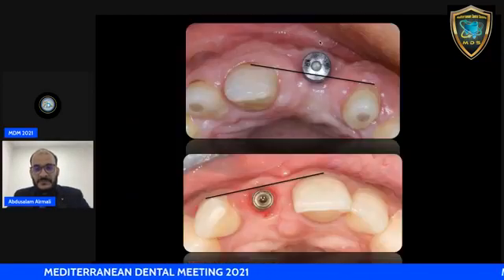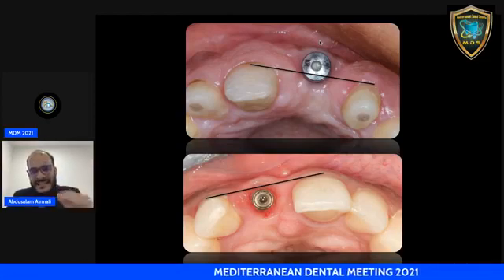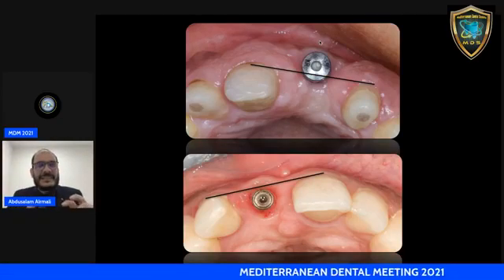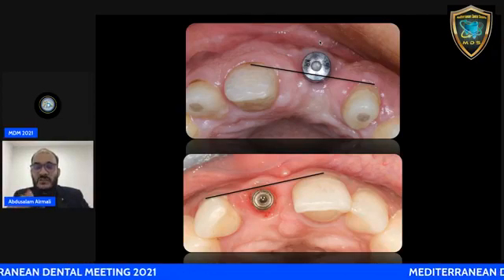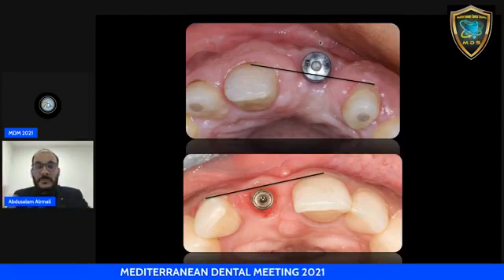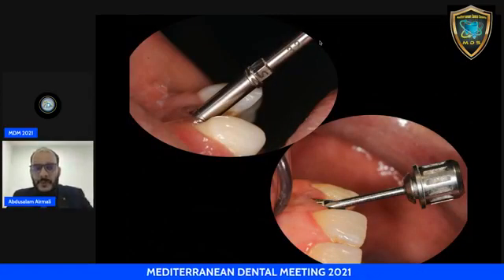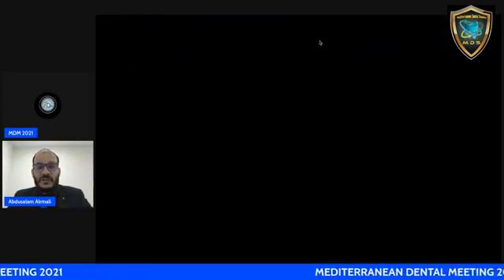The other factor you have to bear in mind, this is a very critical factor, is the position of the implant head. Is it inside the imaginary line connecting the gingival margins of 2 adjacent teeth, or outside this imaginary line? Because if the implant head is outside the imaginary line, this is class 4, according to the Zucchelli classification. And this is most likely to require either a submerged implant technique, or it is better to remove that implant. The other factor is the prosthetic options. Is it possible to do prosthetic management, or is the angulation too big, too much buccally? We cannot restore it even with the abutments that are available in the market.